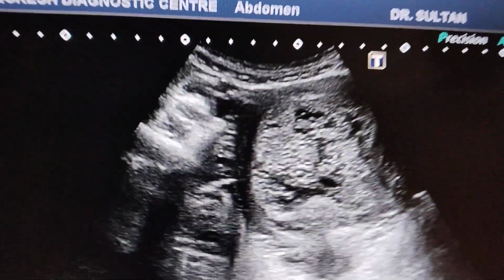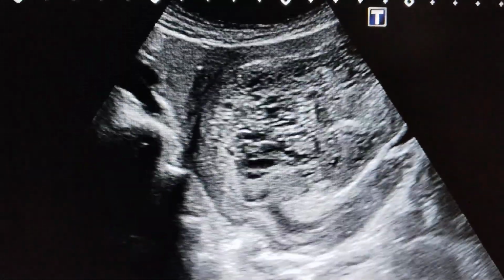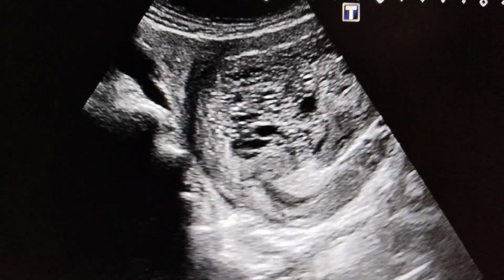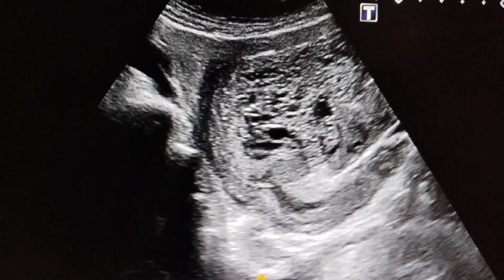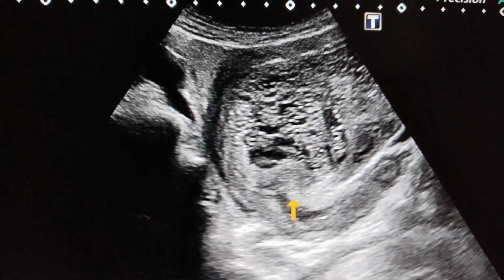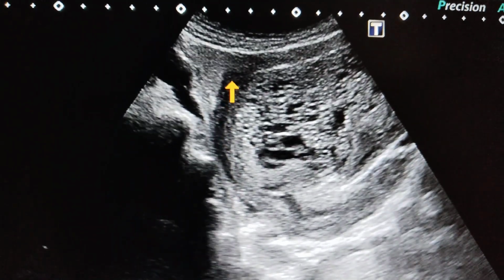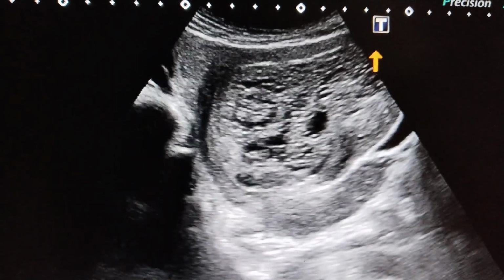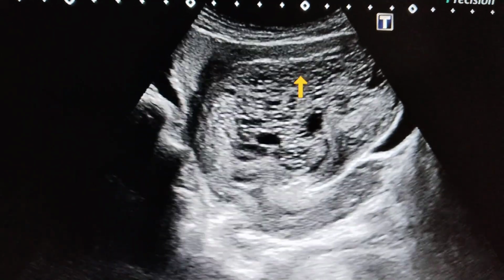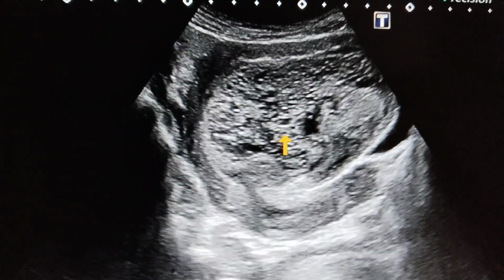Here we can appreciate the pelvic region. Look here, this is the cervix, and this is the body and fundus of the uterus, and this mass is seen within the uterine or endometrial cavity.